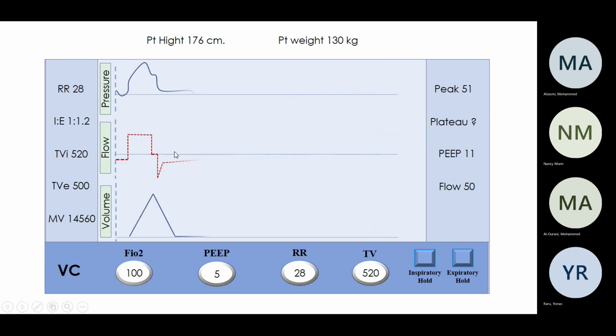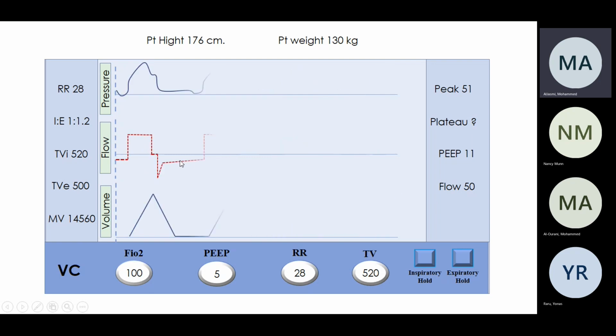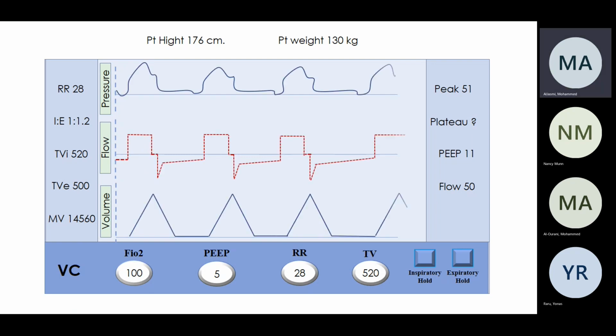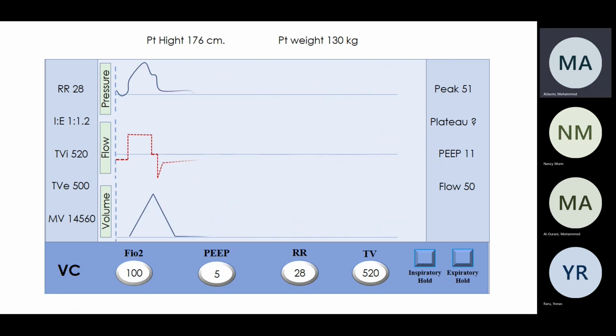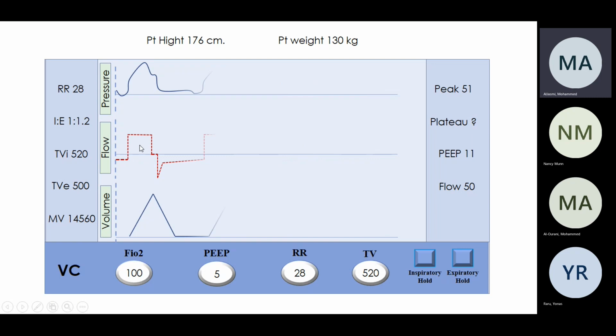Okay, so what's going on? Let's keep Katie now. You did a good part, Ramsha. Catherine, what do you think? Possibly the patient is trying to pull more than what the vent is giving. That's a good point.